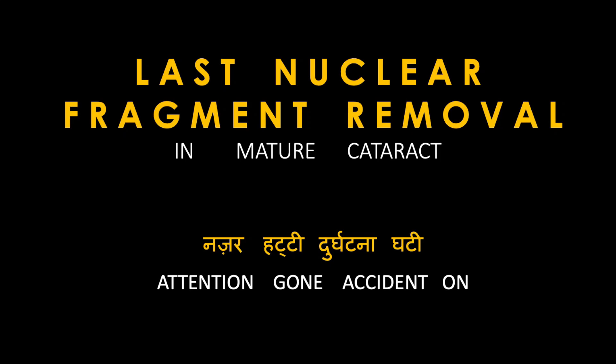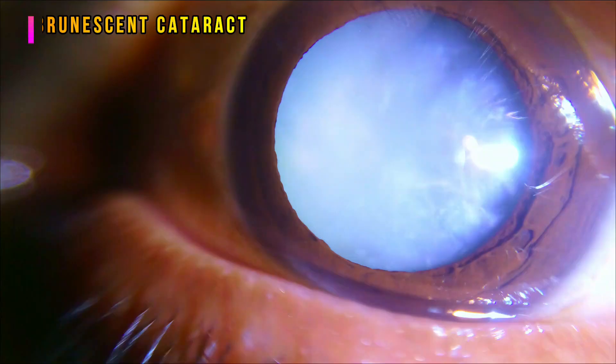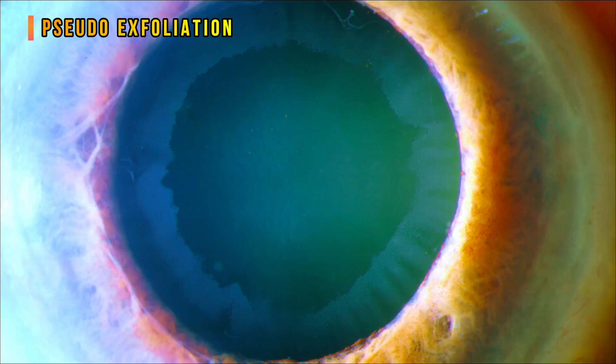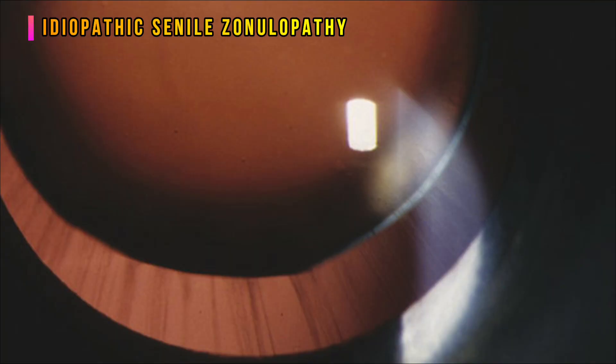The last piece of nucleus removal in mature cataract is known to be the most notorious for posterior capsular tear (PCT). Laxity of the posterior capsule is mainly noted in patients with mature cataract, brunescent cataract, and patients with zonulopathy due to pseudo-exfoliation, senile zonulopathy, or other forms of zonulopathy.